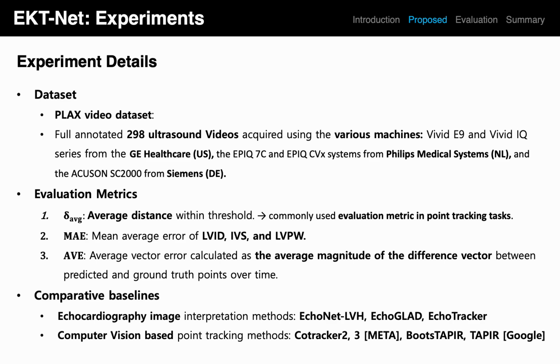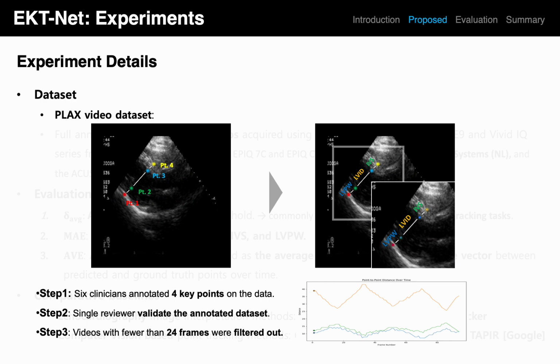The next section covers the experimental details. First, regarding the dataset construction, we evaluate our method using acquired PLAX-view echocardiography videos. Our dataset includes 4 key point annotations per frame.